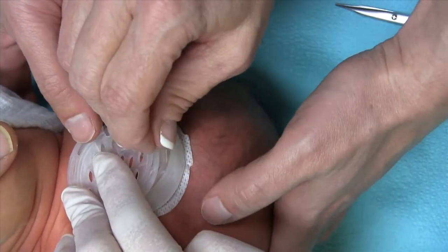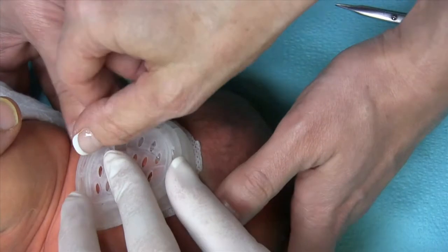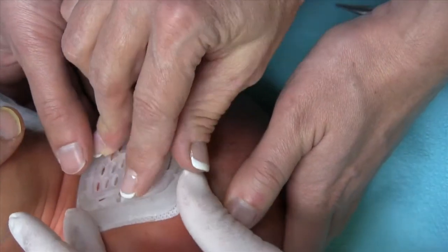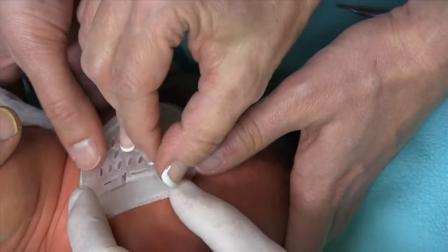Does that block the hearing? No it doesn't. It does not go down into the ear canal. When we think about things blocking hearing, typically that would be if you had earplugs for sleeping. But this does not go down into the ear canal — it's not interfering with hearing.